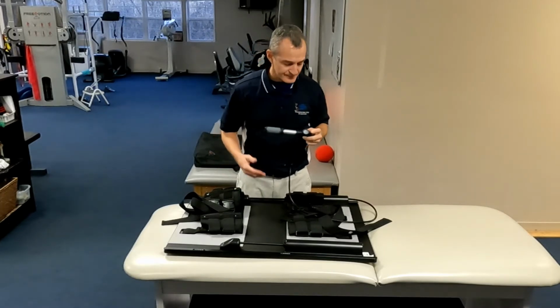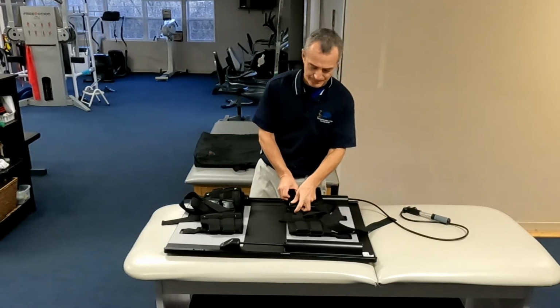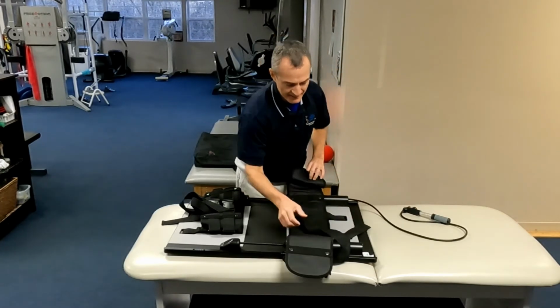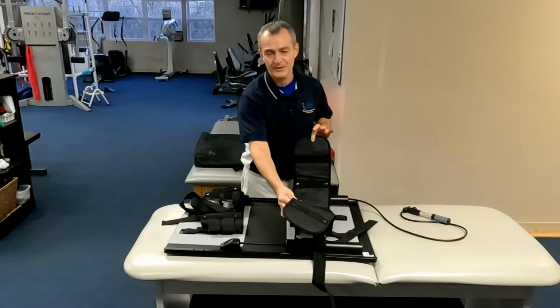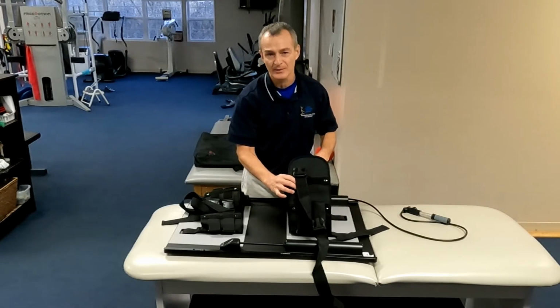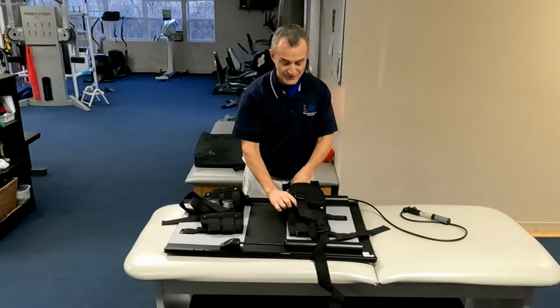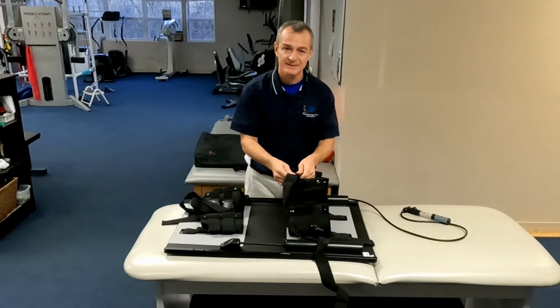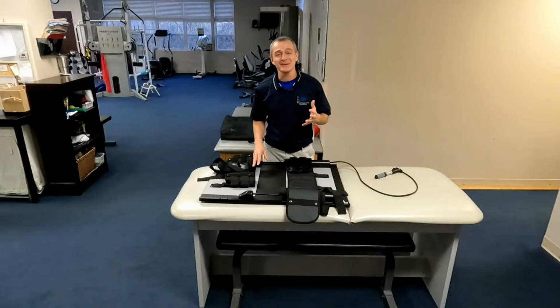So guys, other little pieces of this. So we have these clips. Here is where the first time you use it, you'll set this and adjust it to your body size. And then for subsequent uses, these little devices just clip right in.